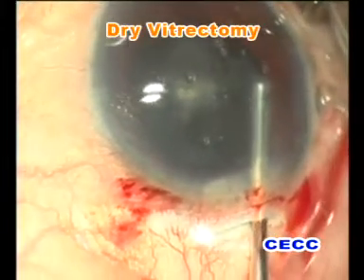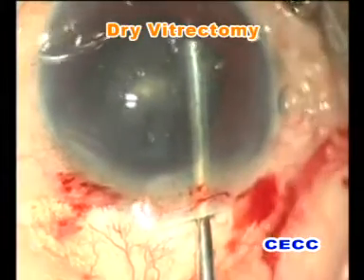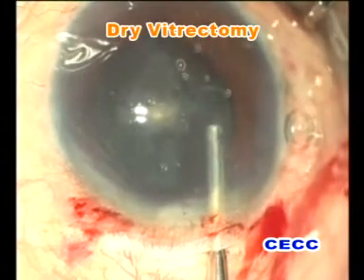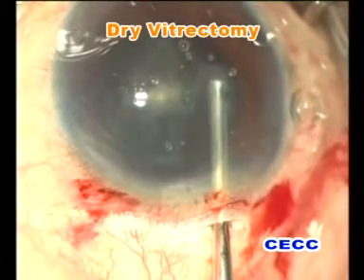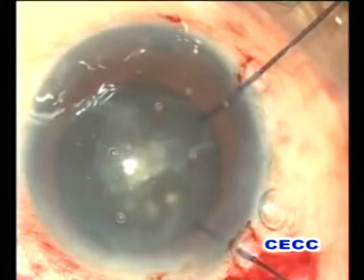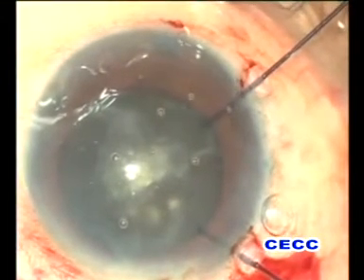Ideally, vitrectomy is performed through a tight-fitting wound. But in this case we did it from the main incision, taking care not to allow a shallow anterior chamber by injecting viscoelastic into the anterior chamber as and when required. In this case, unlike in the previous case, we wanted to continue with phacoemulsification.